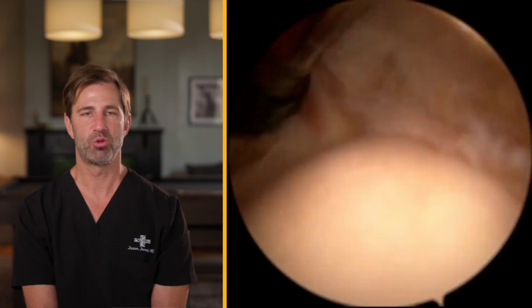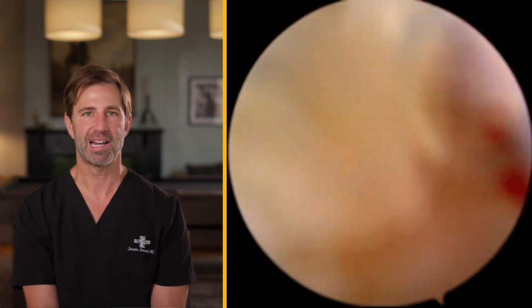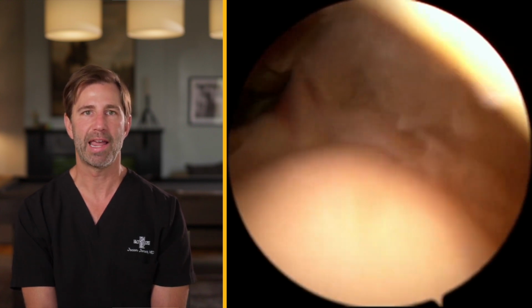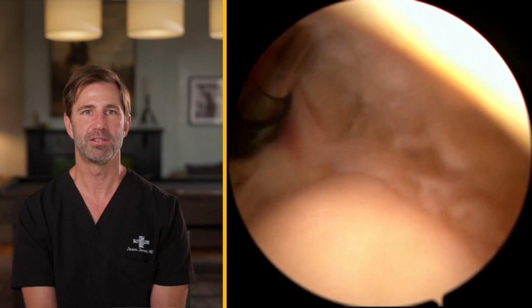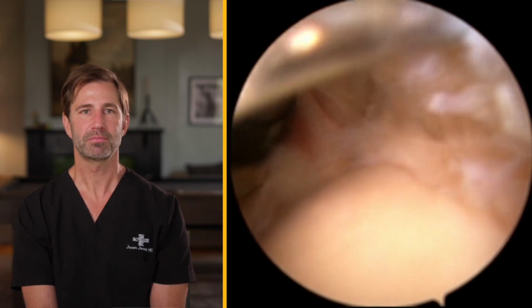What this means is that we're removing this damaged portion of the biceps and we'll reestablish an attachment of this further down the arm. This removes the sharp 90-degree angle that we see with the biceps tendon that often leads to pain and also problems with function.